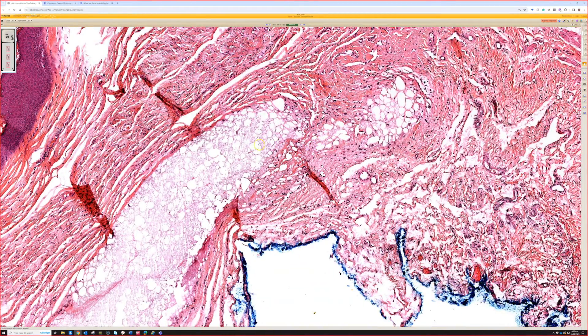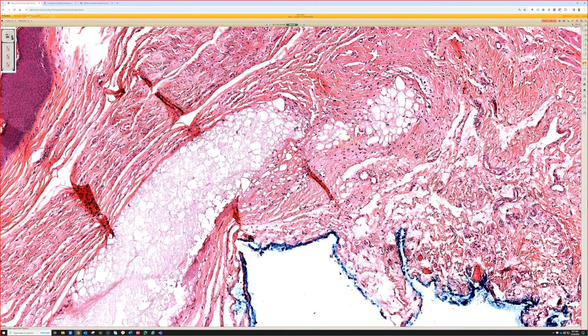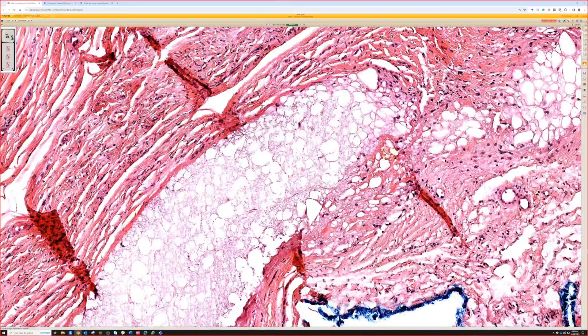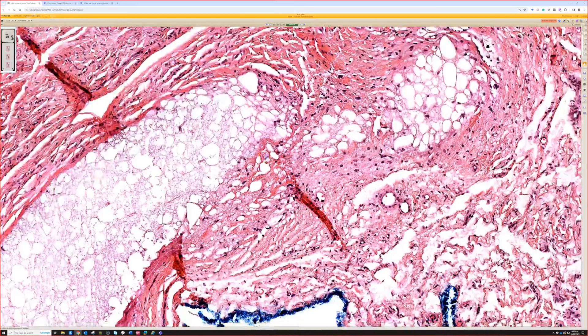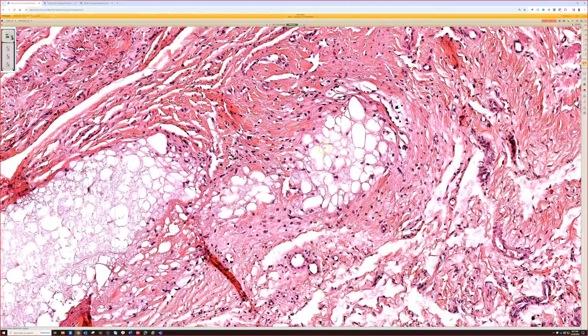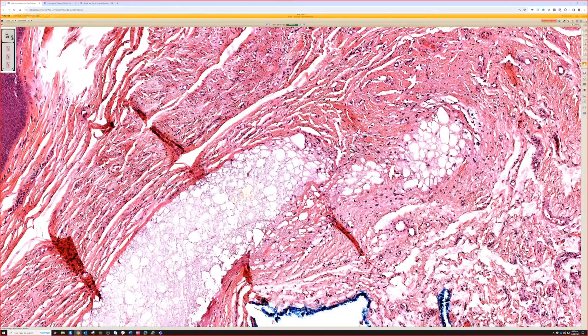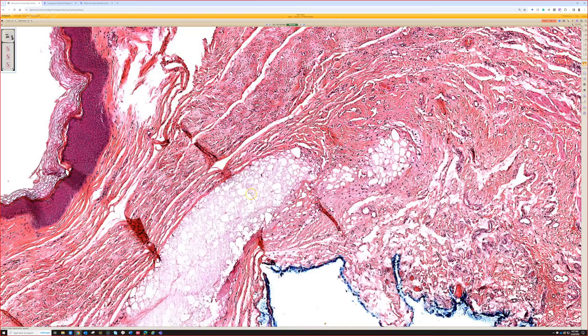There are some histiocytes, so this would be good for triamcinolone injection. Excellent. Very good. Yeah.